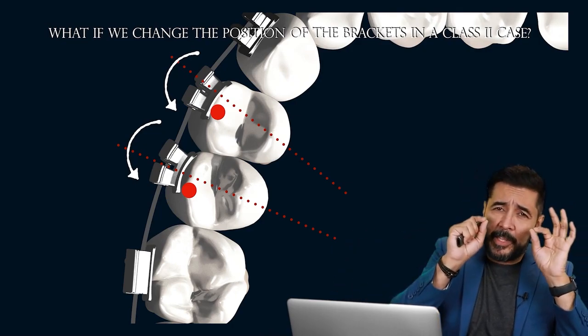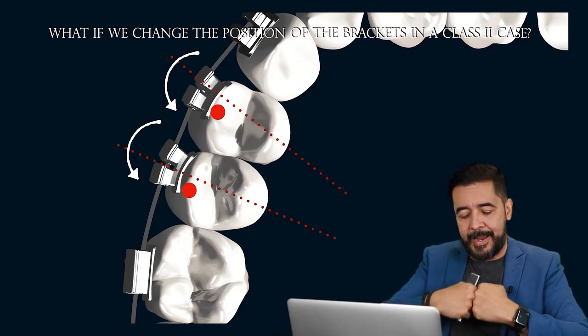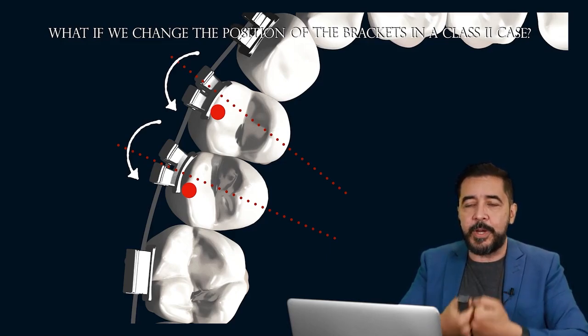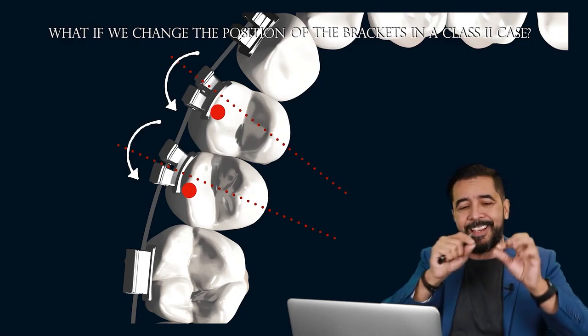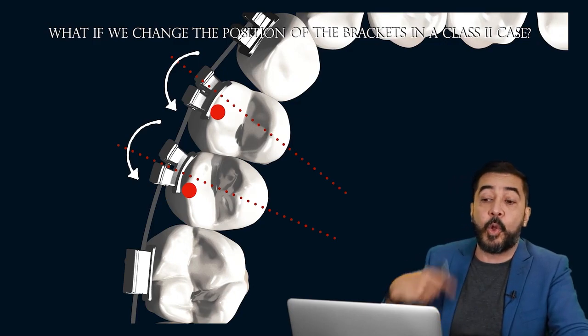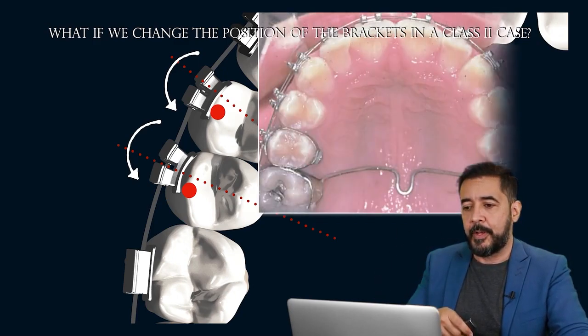It's just a little trick that will help you to finish in a better intercuspation. And I have to admit that I do that often. I really like to do this kind of movement, because the intercuspation, the interdigitation of those tips in that position between two lower teeth, it's very beautiful. Let me show it now to you.